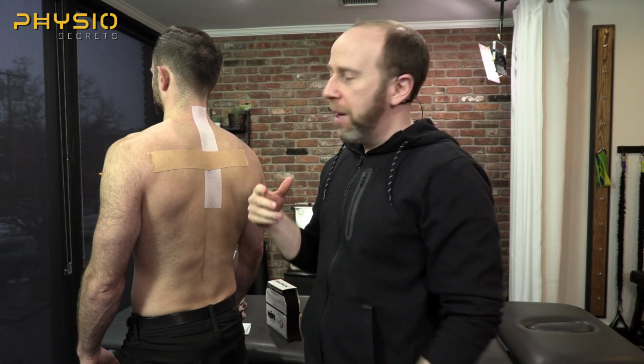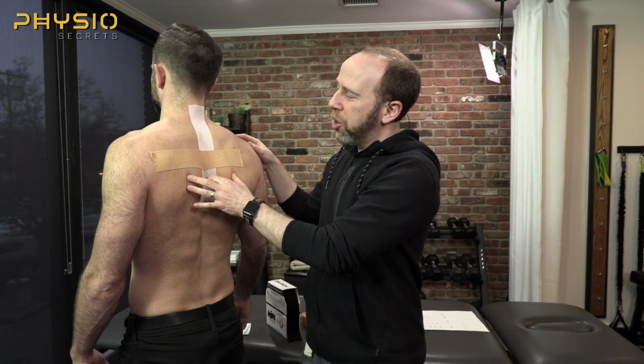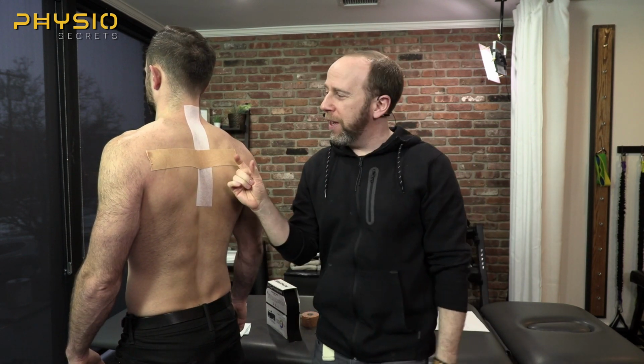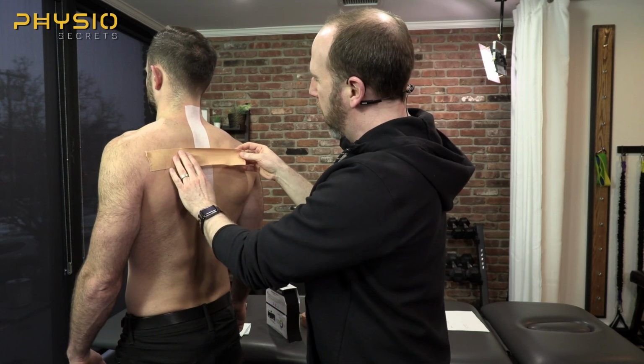So again, we have the same issue. Now, can you retract a little bit? Does the tape stretch ever go away? About here, it goes. Okay, so he's got to retract quite a bit. Now, I did put quite a bit of tape stretch on there, so I can modulate the amount of stretch. But you'll notice how finicky doing this is. I mean, if I tape this and I apply too much stretch, he feels it all the time. I'll apply too little stretch.